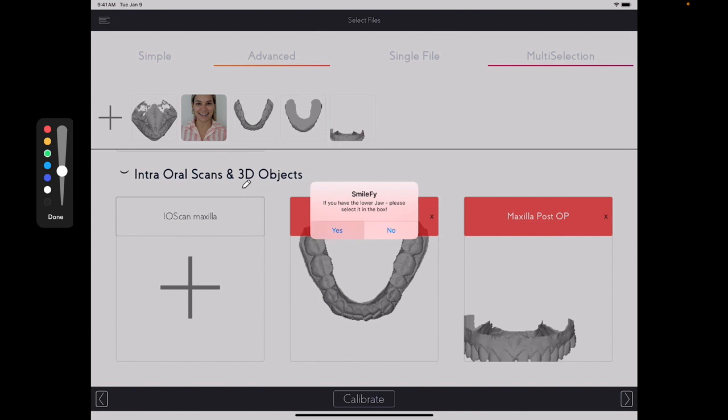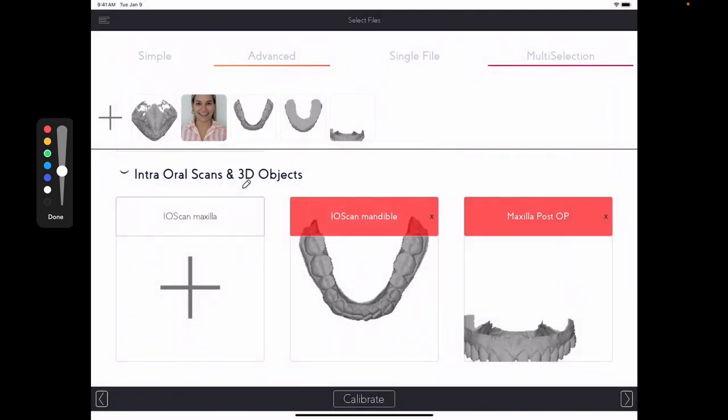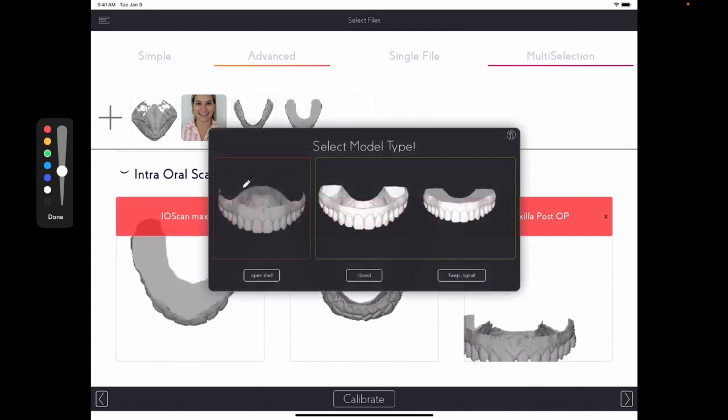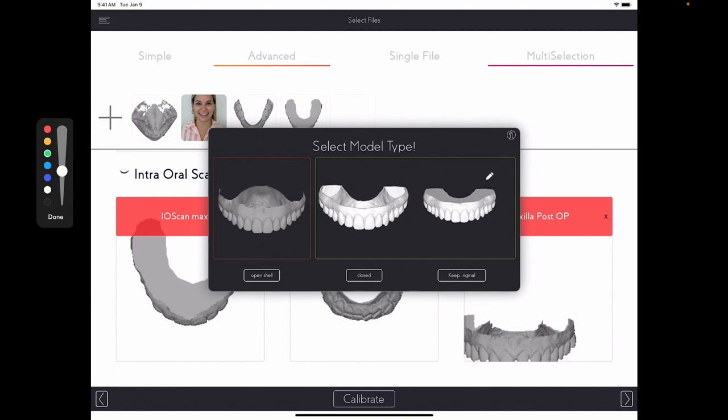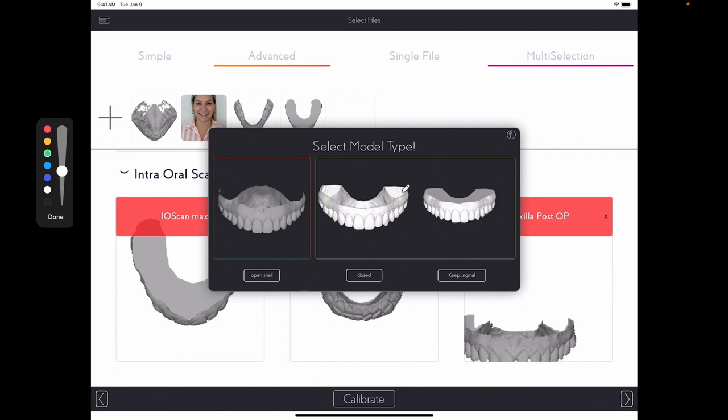Here, it's just asking if I have more files to add. Here's my upper intra-oral scan. When you add all the files, the software will ask if you have already closed the model, which basically means that if it's closed, meaning if it looks like one of these two files here, it is actually ready to be 3D printed because it has this thickness here on the mesh. It's kind of like thick or it has kind of like a tabletop.